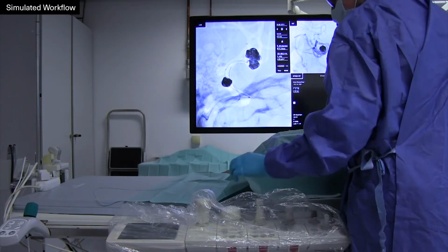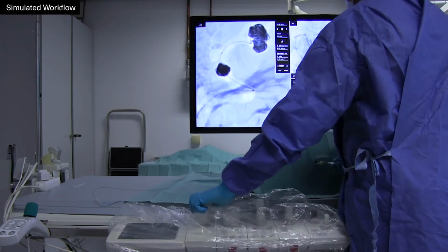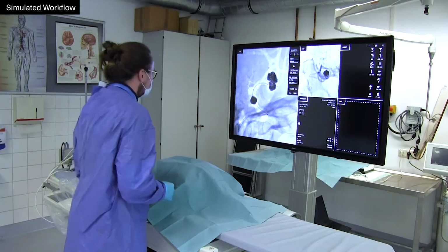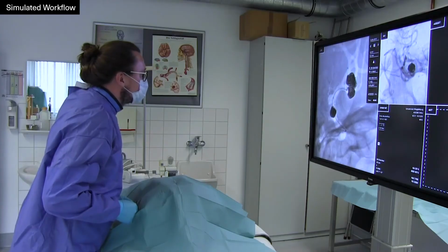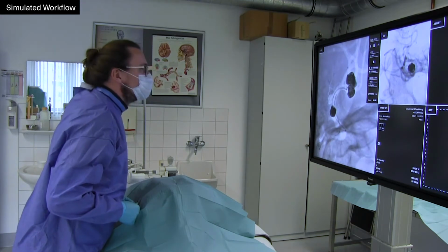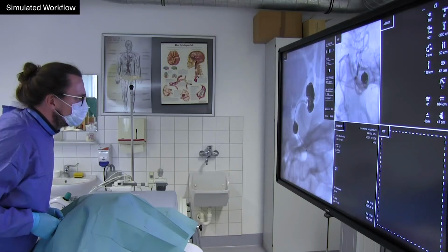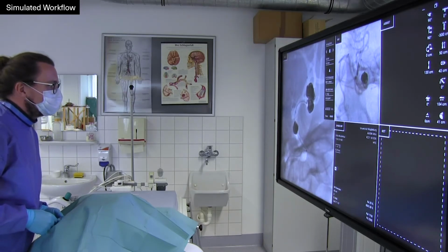Current angiography systems offer the possibility to interact intraoperatively with these image data on a monitor. Within the system, medical image datasets or viewports on the screen can be selected, functions executed, or modes changed by a control panel with joysticks, buttons, touch displays, and additional foot pedals. The data can be manipulated in 1 or 2 dimensions using these control elements.